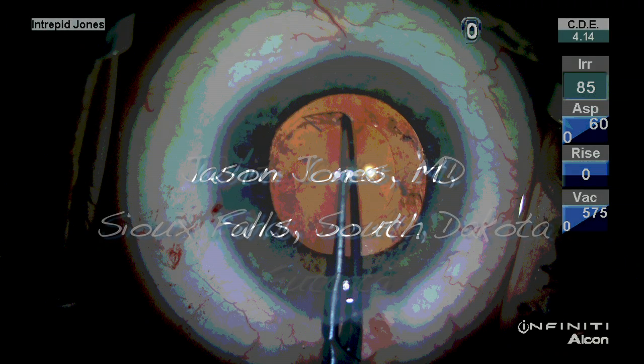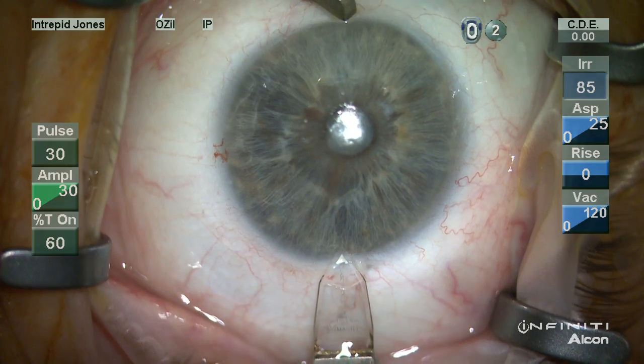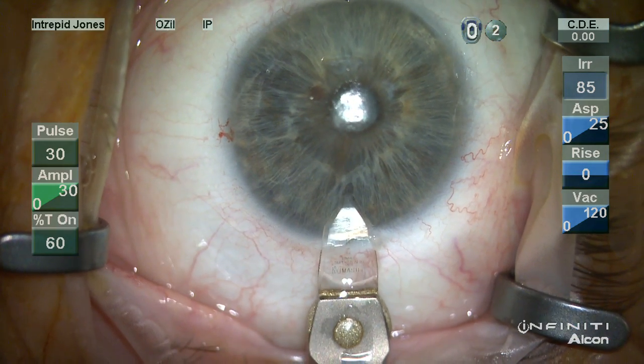Hello, my name is Jason Jones. I'd like to present to you a case of a white cataract with a shallow anterior chamber and significant corneal guttata.